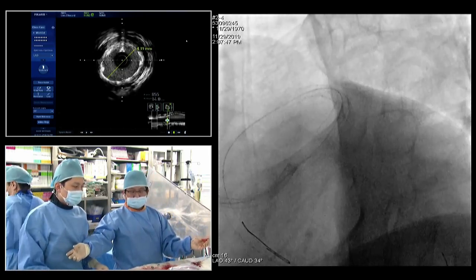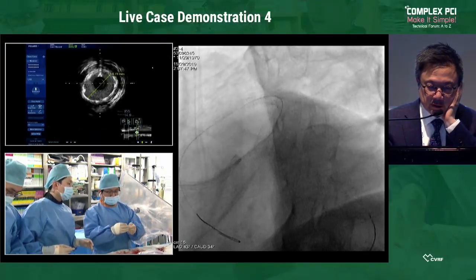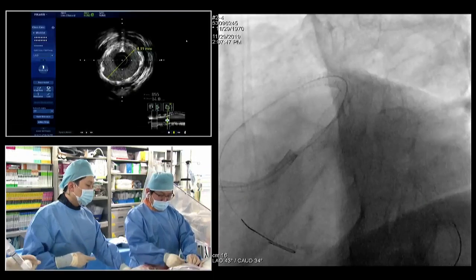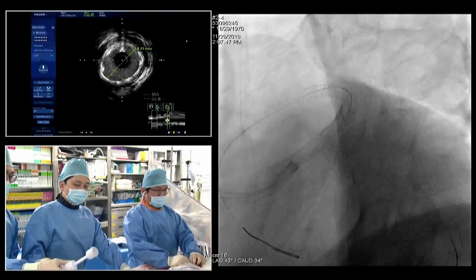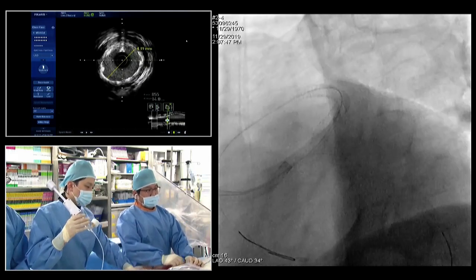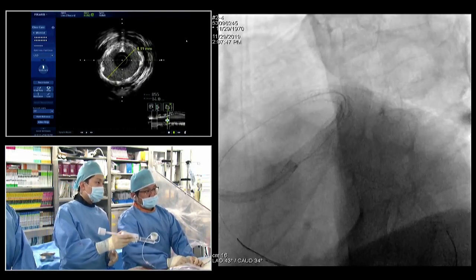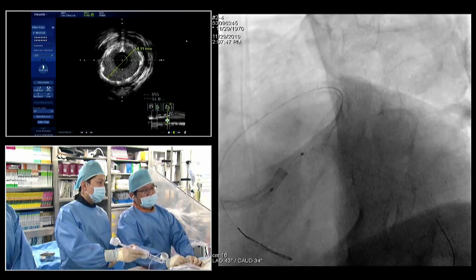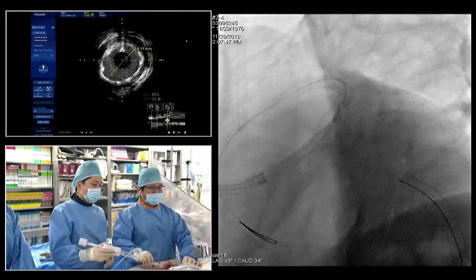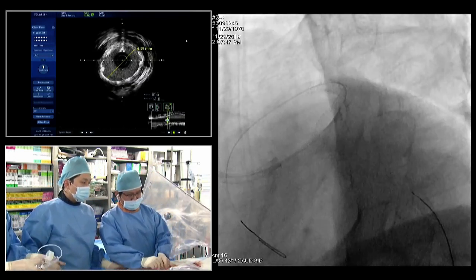Dr. An, did you care about which cell you cross, distal or proximal, or in this situation, because it's all stented already, it doesn't matter too much? Actually, I don't care proximal or distal. Just get across. I only care how big I achieve after the final kissing balloon. I just focus on the 5, 6, 7, 8 criteria. Use the balloon. Used one? Yes, use the one. Okay, good. Please give me the kissing balloon, please.